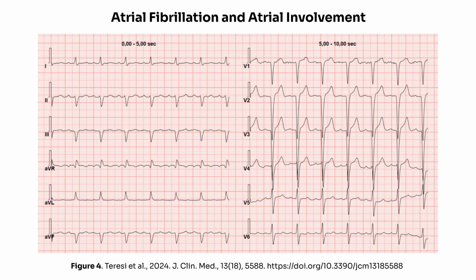So what do we see on the ECG? First, irregular RR intervals with absent P waves, which is the hallmark of AF. Second, even outside of active fibrillation, patients may show prolonged P wave durations and abnormal morphologies, indicating delayed interatrial conduction. And third, low atrial voltages are commonly seen, suggesting that the atrial myocardium has undergone significant amyloid-induced myopathy.